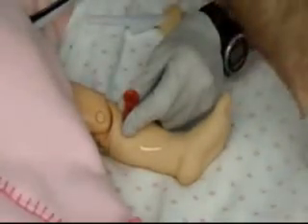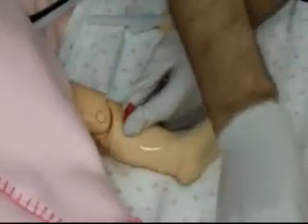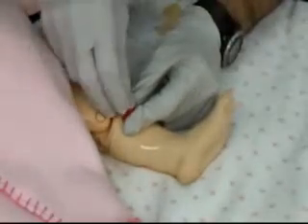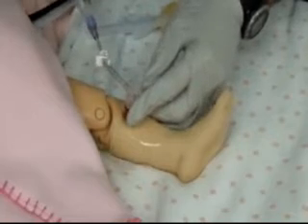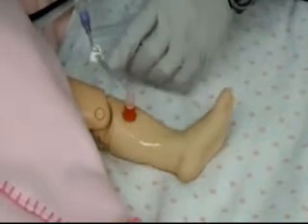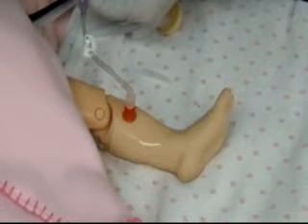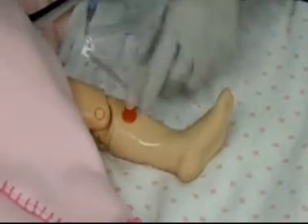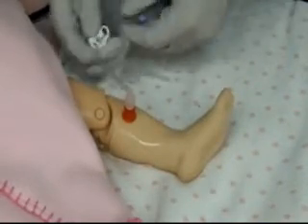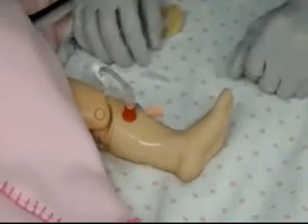Remove the driver, remove our stylet, dispose of it in an approved sharps container, and attach our IV lock. We're then going to aspirate on our needle to see if we have any return of bone marrow, and after that we're going to flush the site to assure that there's no swelling or infiltration around the IO catheter. And this completes the insertion of the EZ-IO.